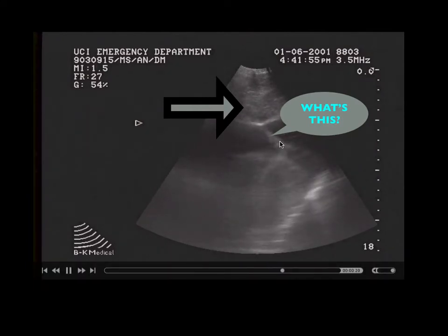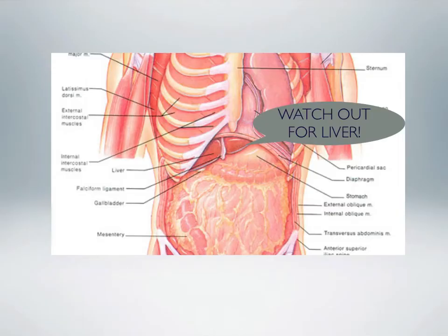We'll explain now why it is not typically too crucial that the liver has a needle going through it. Just looking at the anatomy here, you can see that if you go subxiphoid at a 45-degree angle, aiming towards the shoulder, one just about has to go through an area of the liver. But you're using a fairly thin needle, and if you recall, a person who has a liver biopsy has a very large core of the liver removed, and there are usually no untoward side effects. The bleeding will typically stop.